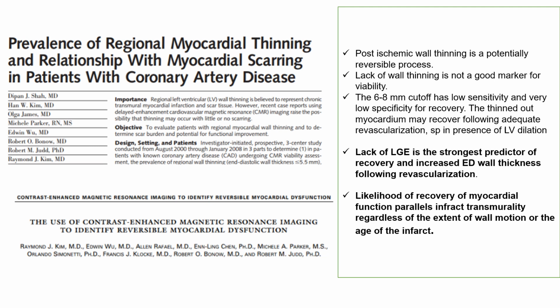Traditionally echo has been used, and it has been postulated that if the myocardium is thinned out, then it's probably dead and not viable. However, there are multiple articles now showing that wall thinning is actually not a good marker for viability, and the 6 to 8 mm cutoff has very low sensitivity and specificity for recovery.